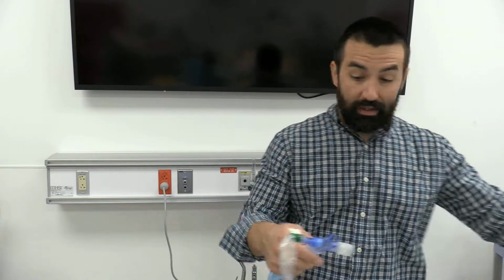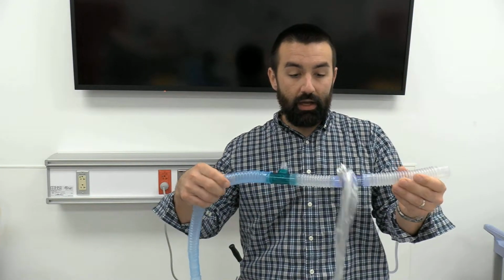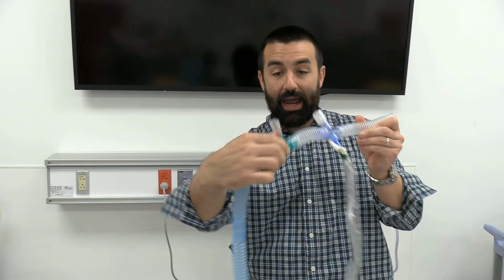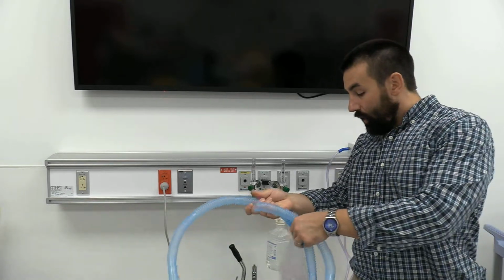You would need another piece of tubing, and it doesn't have to be right there at the patient, but you want it pretty close to know what they're getting. Now we can monitor the temperature of that gas coming out of this device. It's going to cool off as it gets further away because this tubing has no heating, unlike some of our other systems.